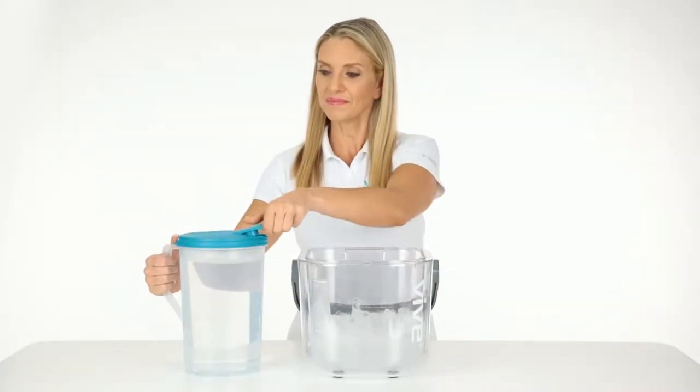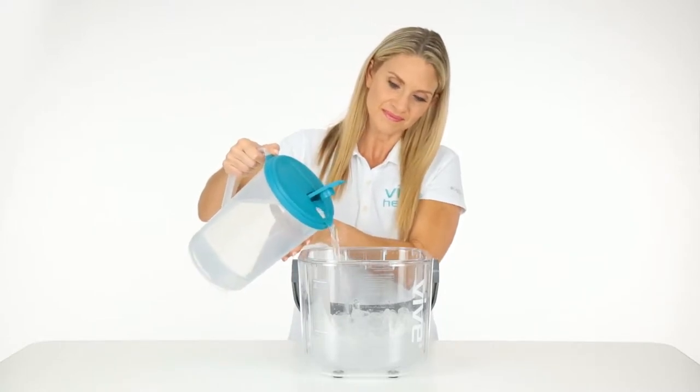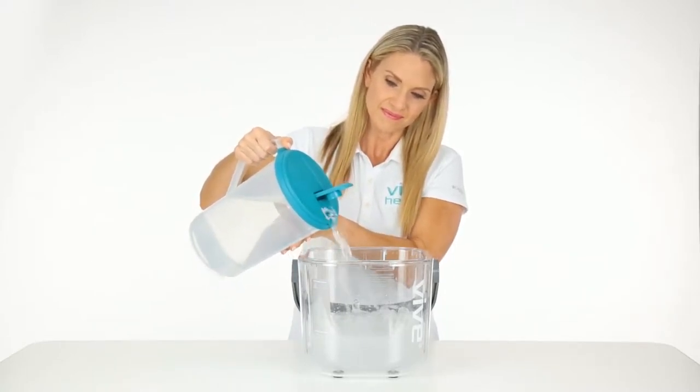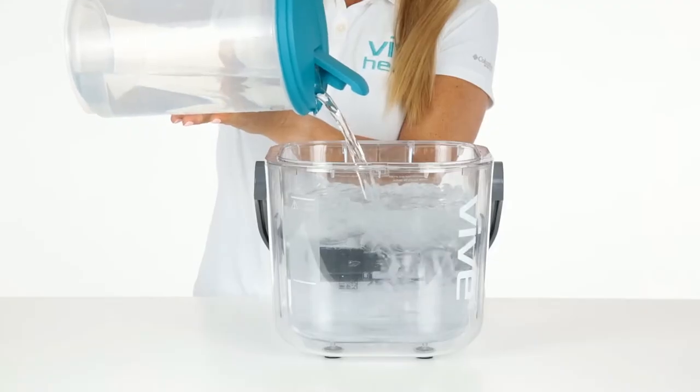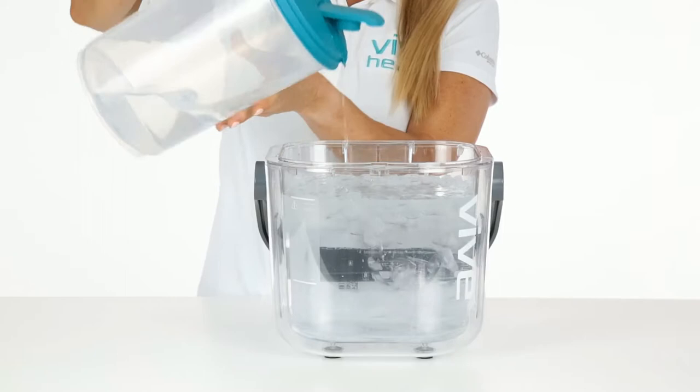Next, add cold water to the bucket, making sure that it reaches the top of the water fill line.